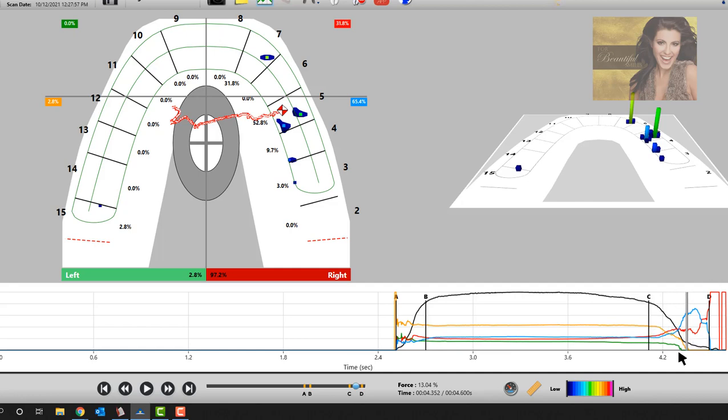So if you're going down the route of T-scan, make sure you get a good course in, some in-office training with Robert Kirstein or myself to actually understand what this is and what's going on. And those are the people like Curtis Westerson and Rick Coker who've had in-office training, and some others that are in this group are like, yeah, I totally get what Ben's saying. But if you don't have the software or the hardware, C and D lines don't really mean anything to you.